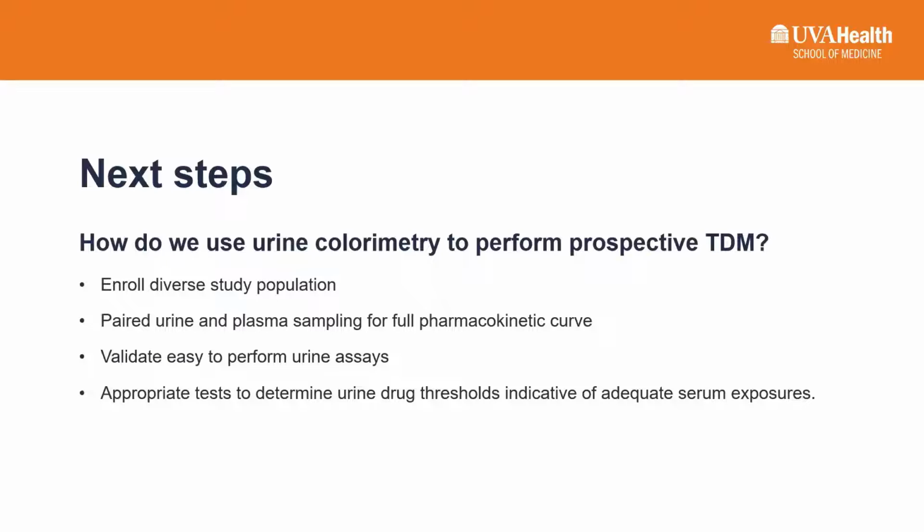different labs. The urine assay that we did initially for the mobile phone light box was done in Virginia and not in Tanzania. To check the validity of urine assays, we wanted to make sure all our partners would be able to work on the assay in their location, because that's essentially the goal. Our goal is to improve TDM in remote settings, so it really makes no sense if they just ship all the samples here and a different country works on it.